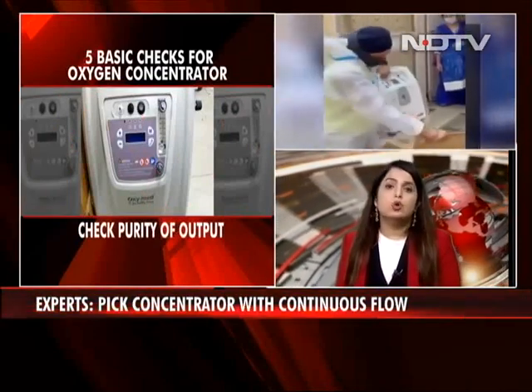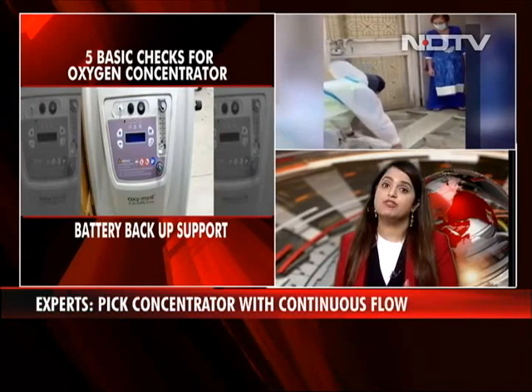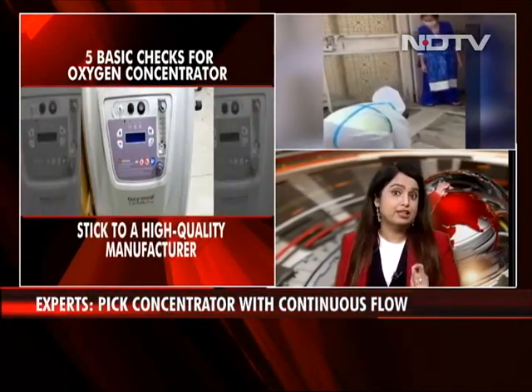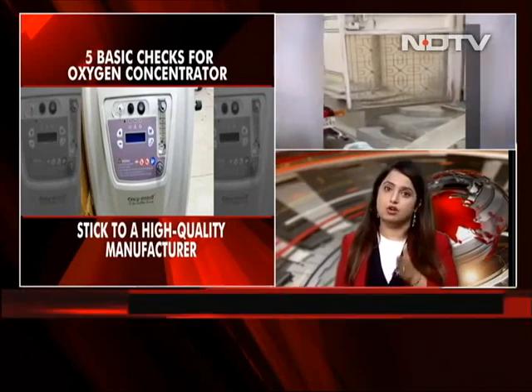To start with, who is it for? An oxygen concentrator is most useful for patients whose oxygen saturation level is above 90%. Any lower and an oxygen cylinder or hospitalization is highly recommended. Now, here are 5 things you need to keep in mind when buying an oxygen concentrator.